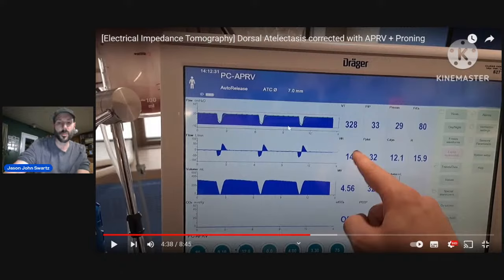So that was like 11 releases here where the CO2 is evacuated. And then I brought it to 6. So then the rate was 9. She had rocuronium, 50 milligrams PRN. Majority of the time we didn't need it, except for when we were changing the positions that would stimulate her.